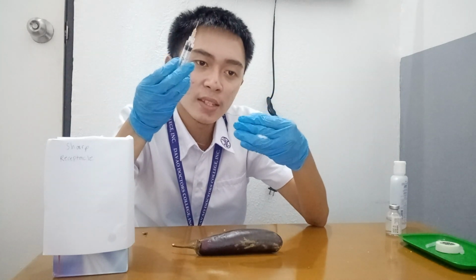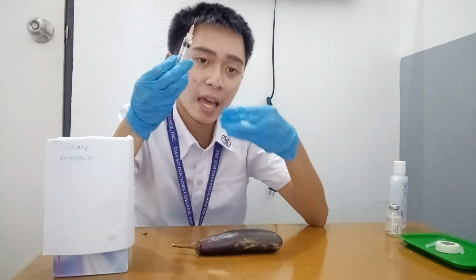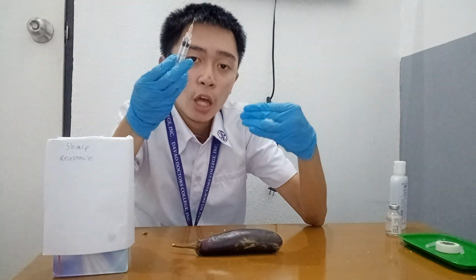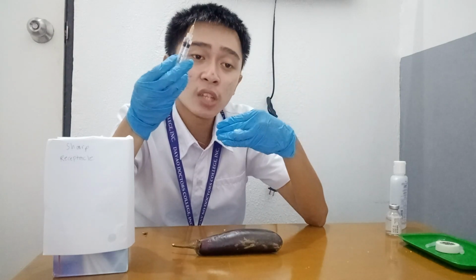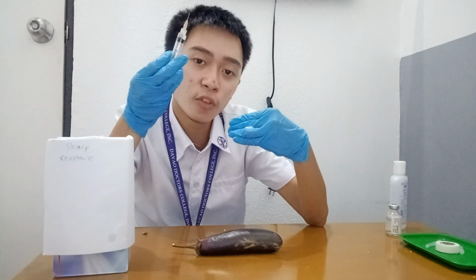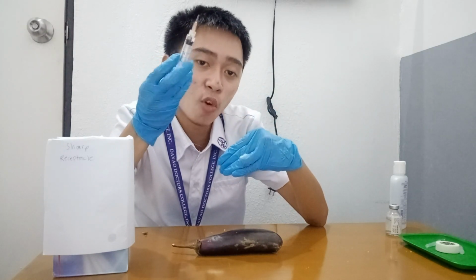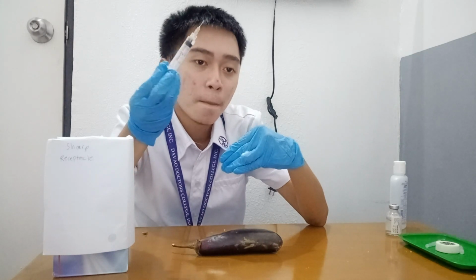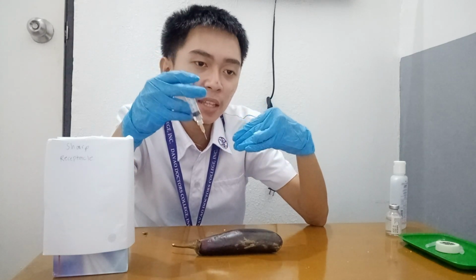Now we are going to advance the needle into the patient's skin. Use the ulnar side of the non-dominant hand to pull the skin approximately 2.5 centimeters or 1 inch to the side. Under some circumstances, such as for an emaciated client or an infant, the muscle may be pinched. Holding the syringe between the thumb and the forefinger as holding a pen, pierce the skin quickly and smoothly at a 90 degree angle.